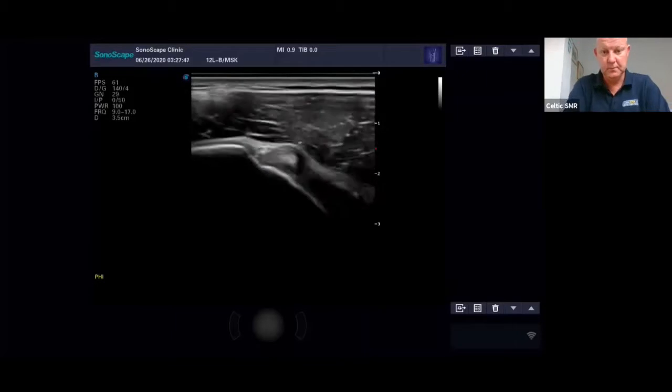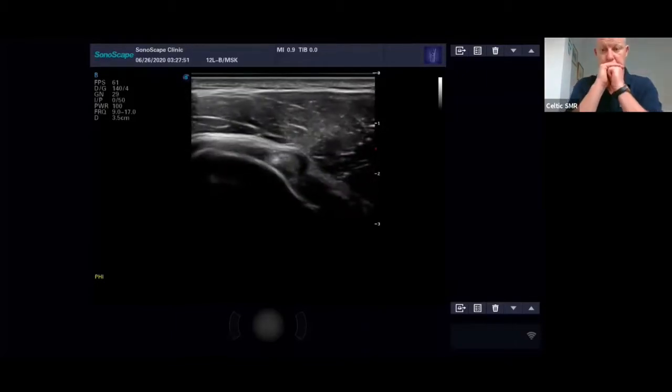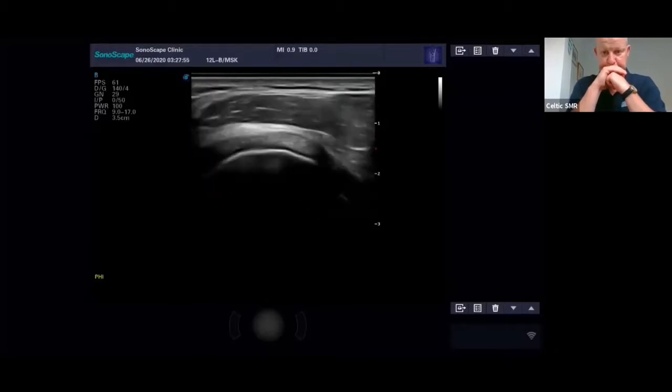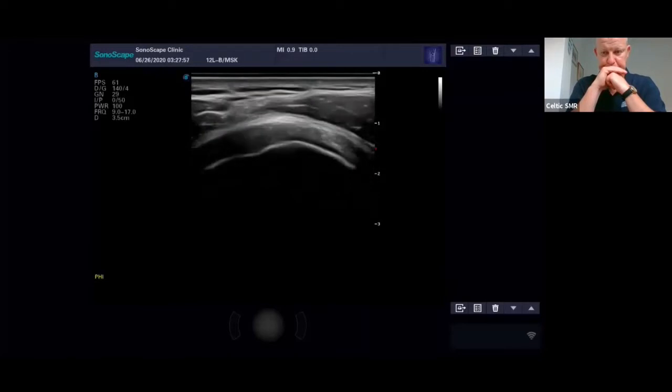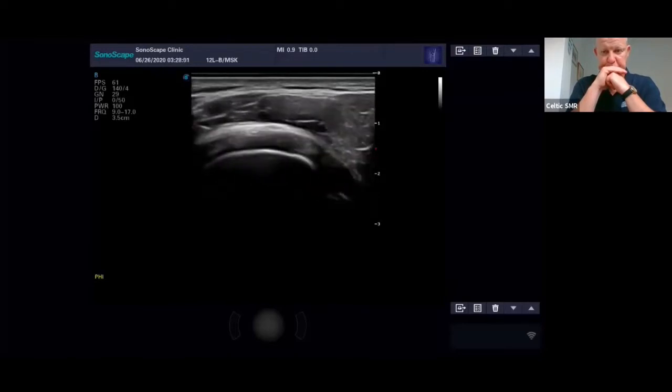That's the biceps tendon again, as I said, which we're going to cover in a couple of weeks, I think. Right, I think I've covered most things there. We'll have a look at the infraspinatus now.